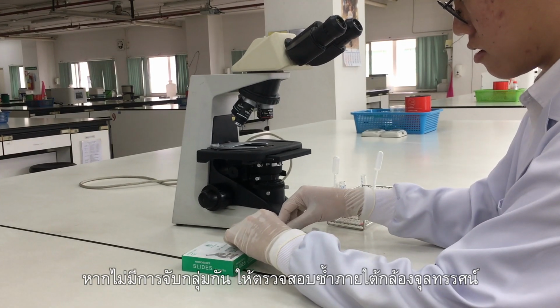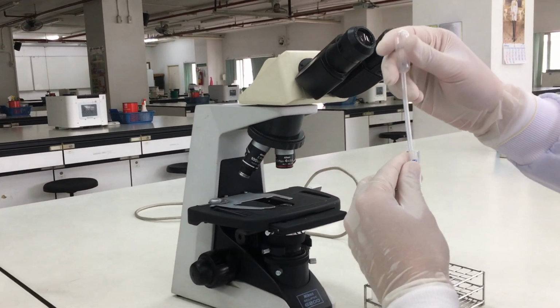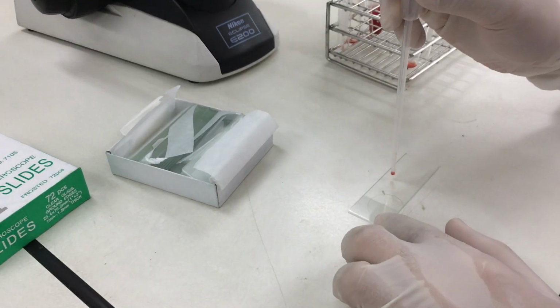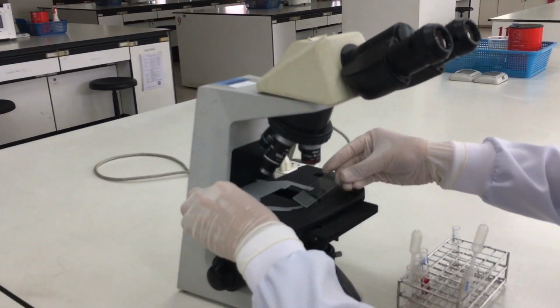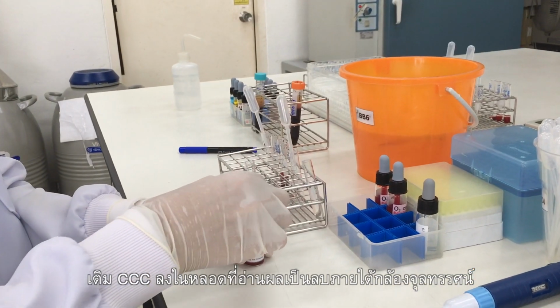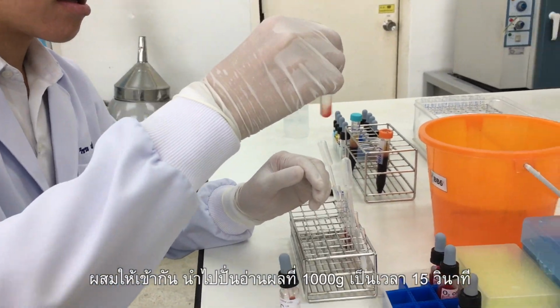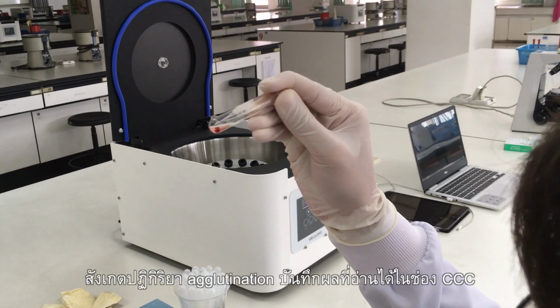If there is no agglutination, confirm the negative reaction under the microscope. If there is no agglutination observed under the microscope, transfer 1 drop of IgG sensitized red blood cells or Coombs control cells. Mix and centrifuge at 1000 G for 15 seconds. Observe agglutination, grade the reaction and record in the CCC phase.